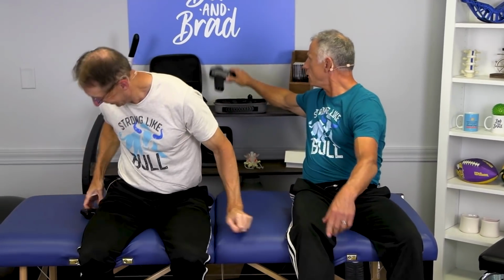Bob, is there anything else you'd like to comment on, like maybe the traction, the gun? Well, just that. We do have the C2 massage gun. I got it going here. Very important. Never massage your neck with a gun like this. Yeah, right. It's not going to feel good. It's no good. You can do it on your traps and stuff, but every other part of your body.